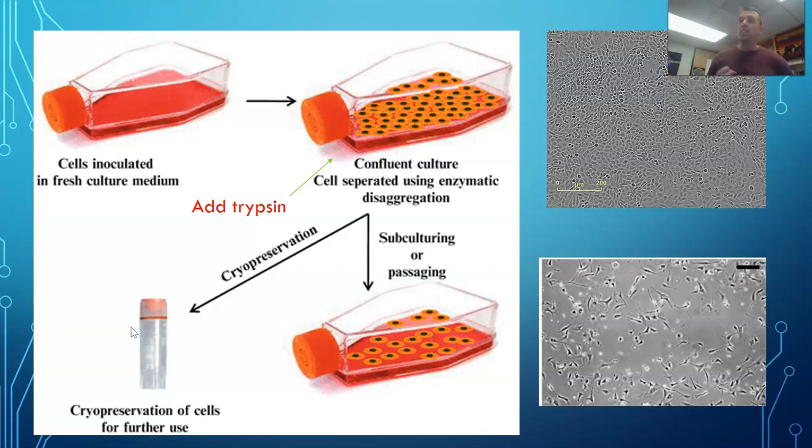We're going to stain the cells. We are going to test the cells for chemotherapy agents, what effect those have on the viability of cells. We're doing a lot of these things with our cells over the course of the semester. We'll talk more about that as those events come along.